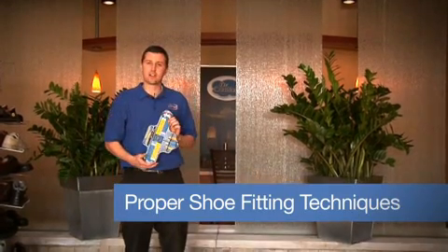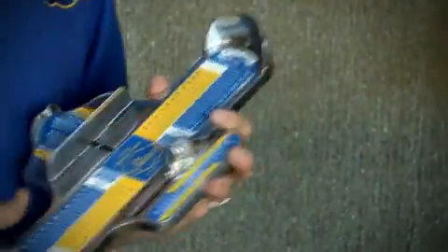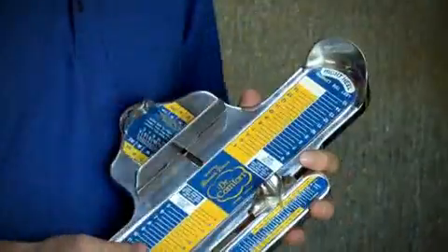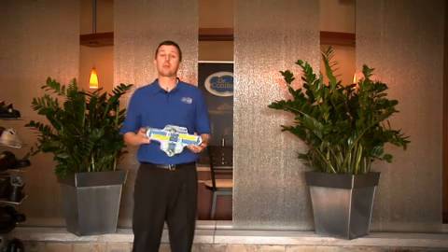Today I'd like to discuss proper shoe fitting techniques using our Brannock device. Now the Brannock device is a very useful tool. It takes 3 measurements: heel to the longest toe, heel to bunion or first metatarsal joint, and also width. This tool could actually be used for both men and women, left and right feet.